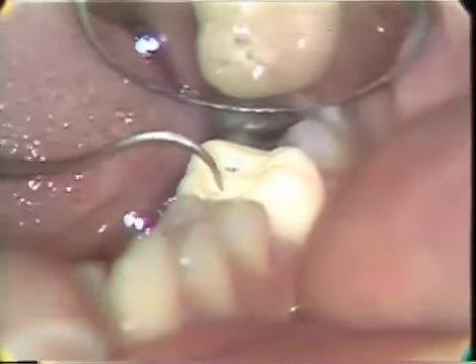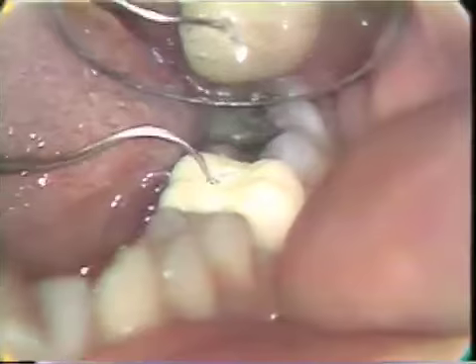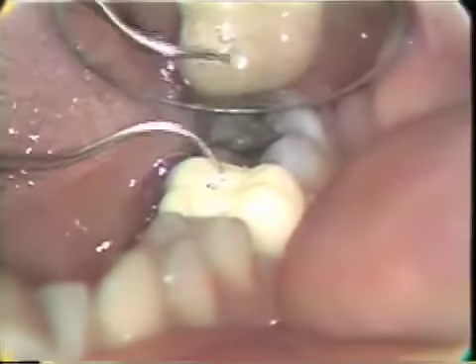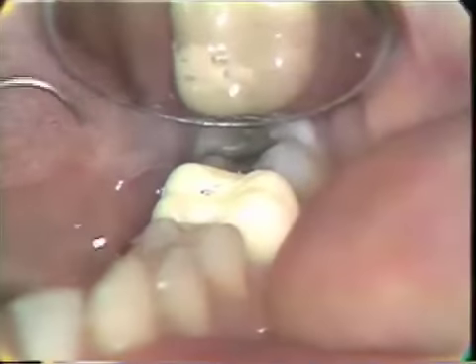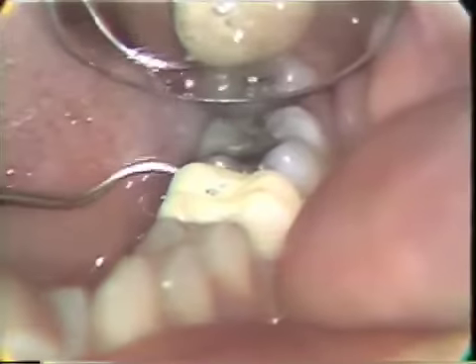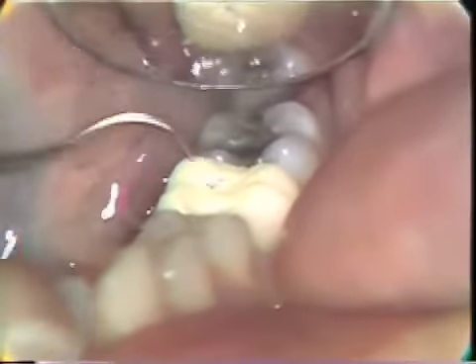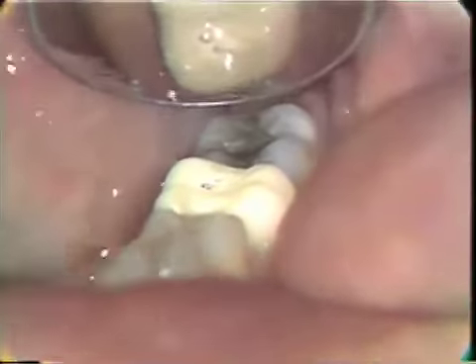This is a porcelain on gold crown where there has been some loss of porcelain here on the occlusal. It was probably removed during the adjustments for occlusion. That would be a very difficult excess to remove and probably practically impossible.